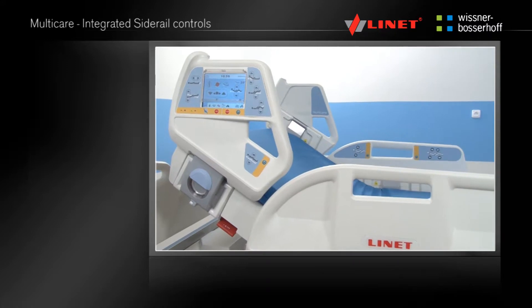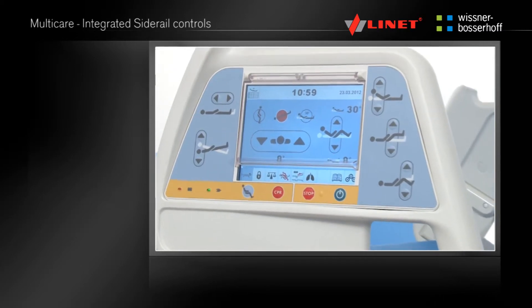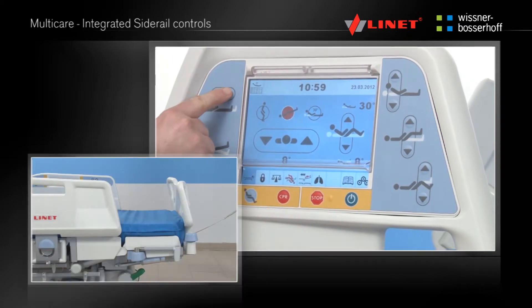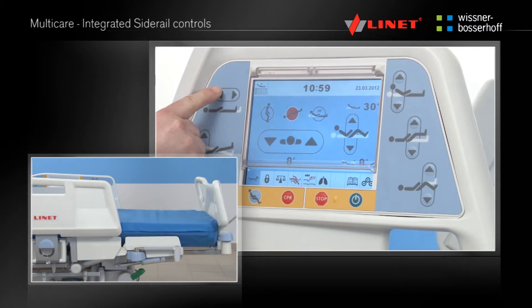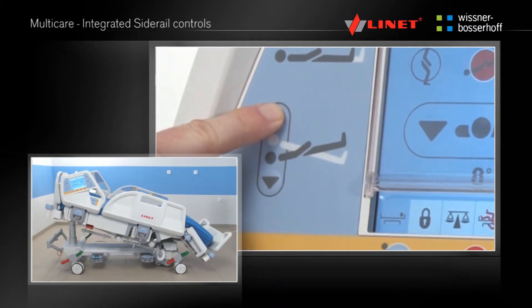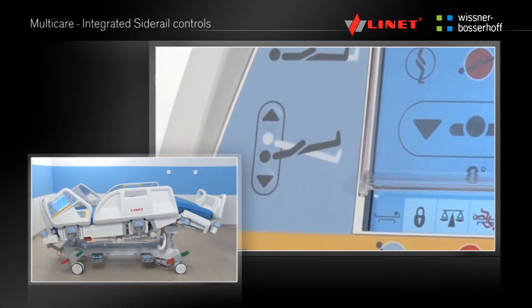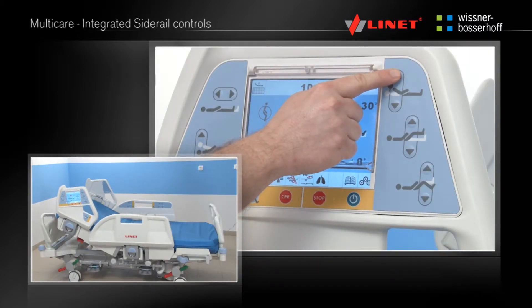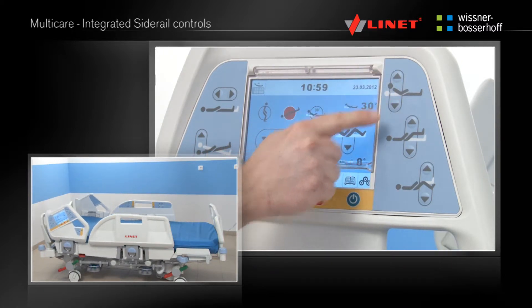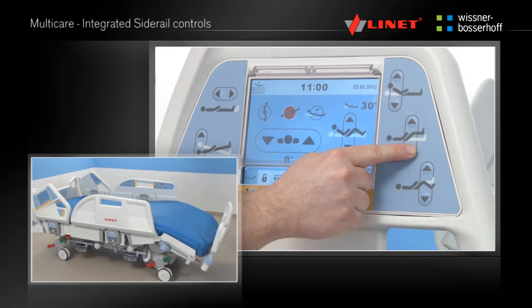The control elements are integrated into the side rails and some of these controls can be used by the patient. They are dual sided so they can be used by the patient and by the staff. The patient has access to only some functions. Before using any function, press the activation Go button.